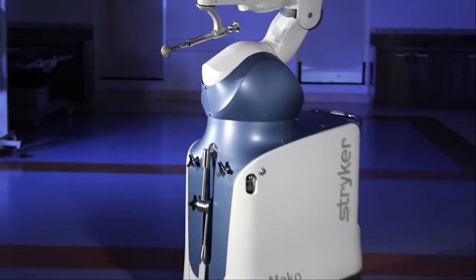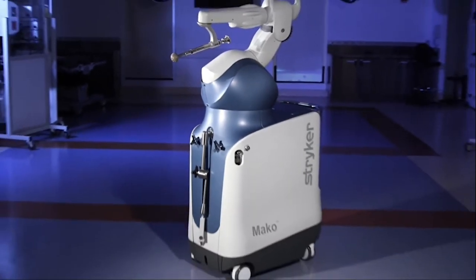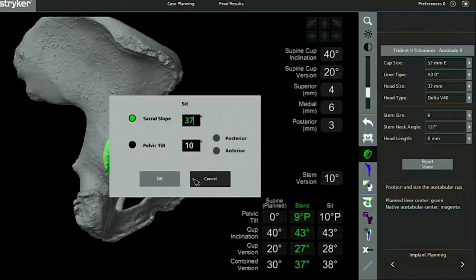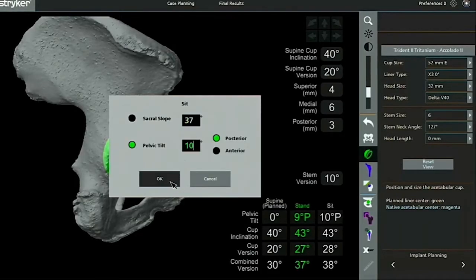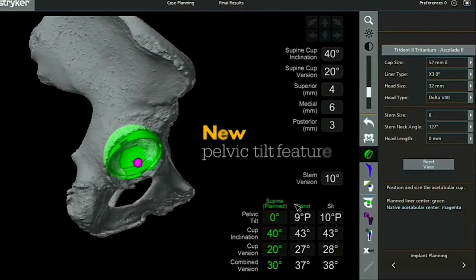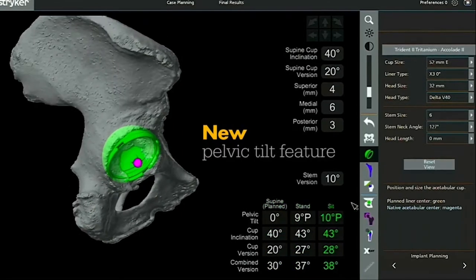Introducing MAKO TotalHip 4.0, with more capabilities than ever before.